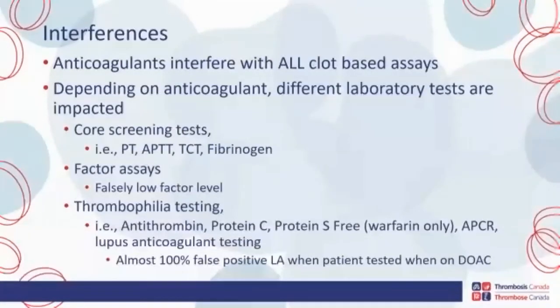Depending on the method that is used for the thrombophilia testing, we could have a false result, either falsely high or falsely low. And realistically, we see almost 100% false positive lupus anticoagulant investigations when we receive samples from patients who are on DOACs.